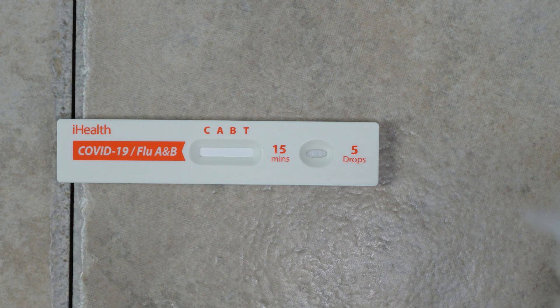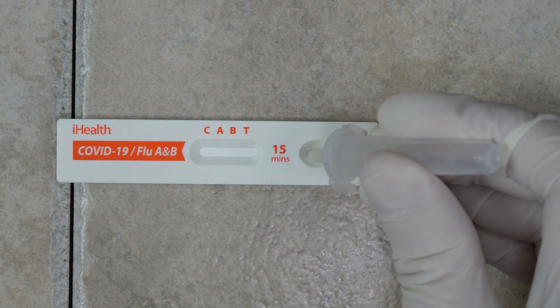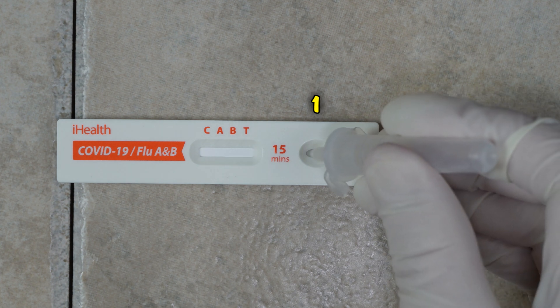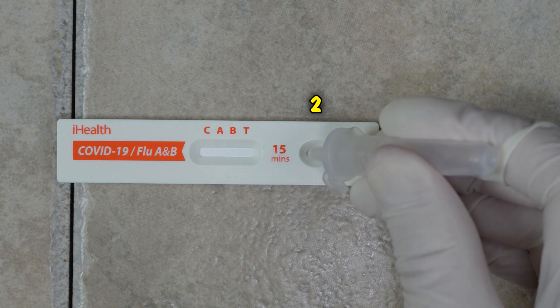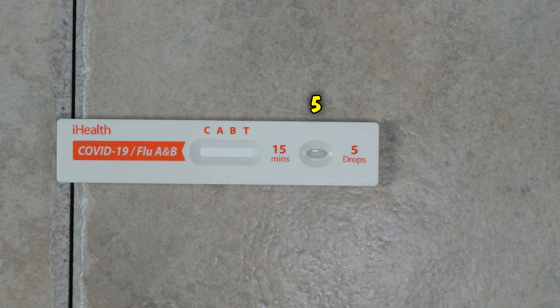You're going to turn the tube upside down and add five drops of liquid into this well right here. Once you do that, just keep the test device in place — don't move it around. I am holding the dropper about a half inch above the test card.